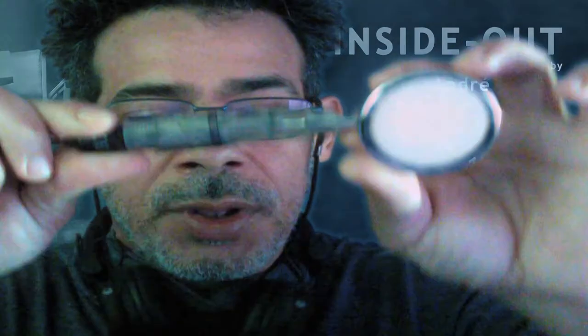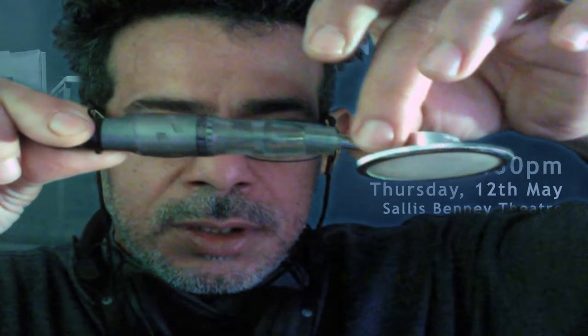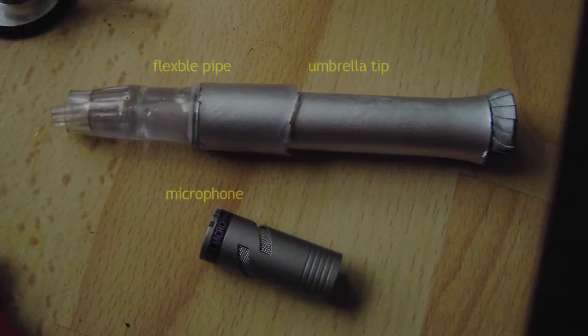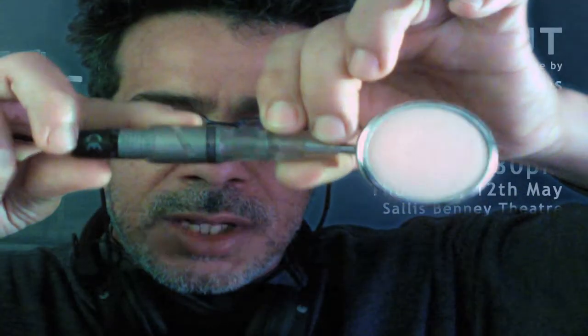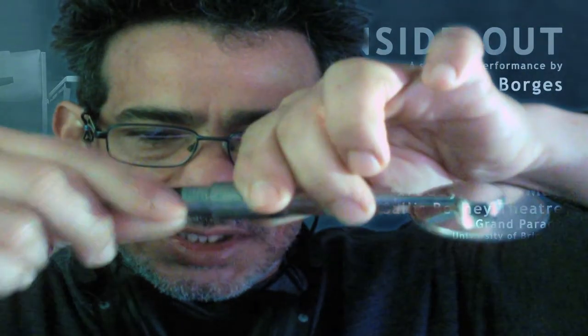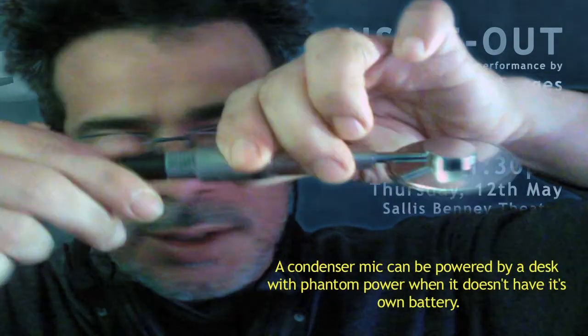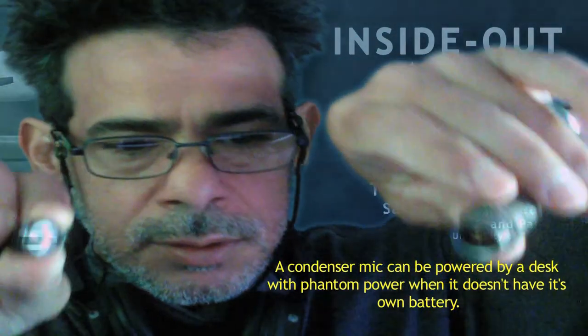Then I attached it to a silicone pipe — you see the other side of the pipe is a bit larger so I could connect the head of a condenser microphone. Here where the battery goes, it has to be a condenser mic, otherwise it's not strong enough to get the sound. Put the battery here.